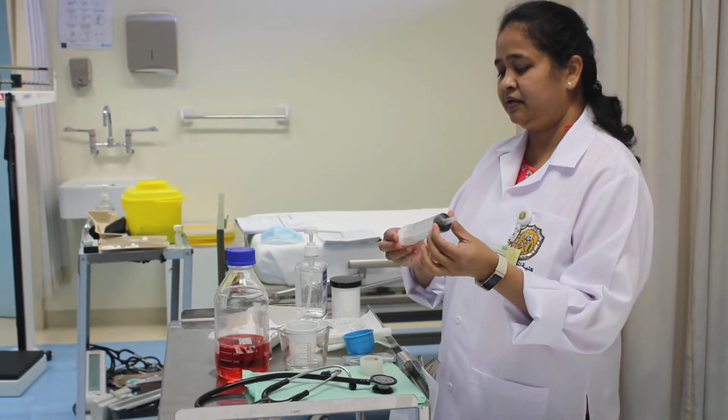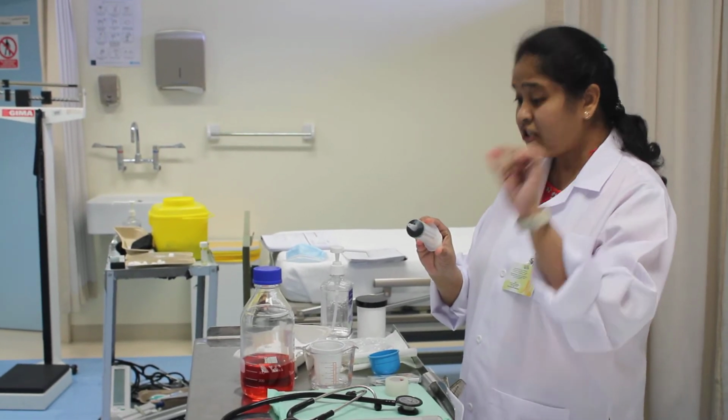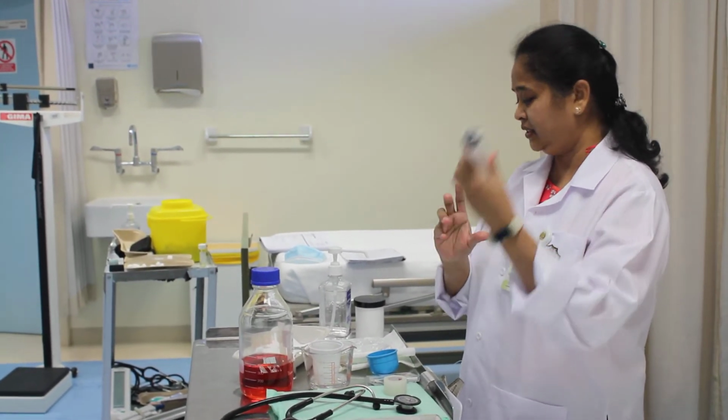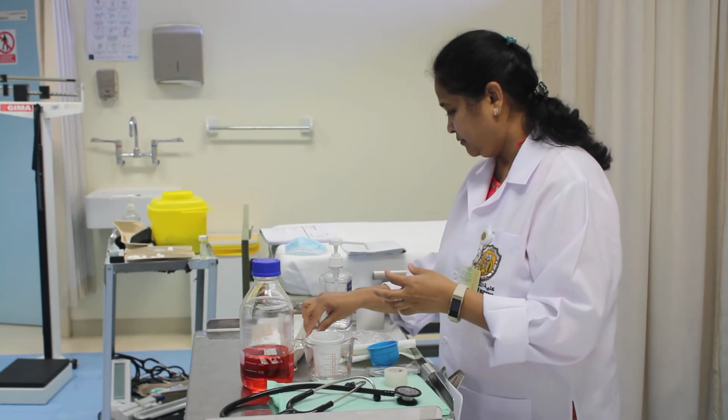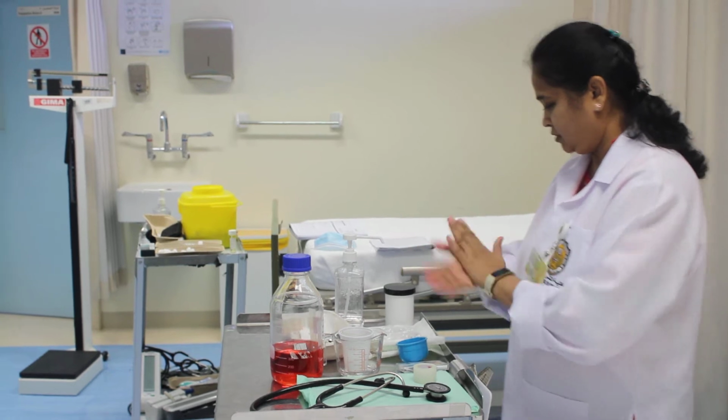This syringe you will find for the first time. This syringe is not for giving any injection. You cannot fix a needle over here. This is called a feeding syringe. And of course I need a keeping tray. I need to have my hand hygiene also.